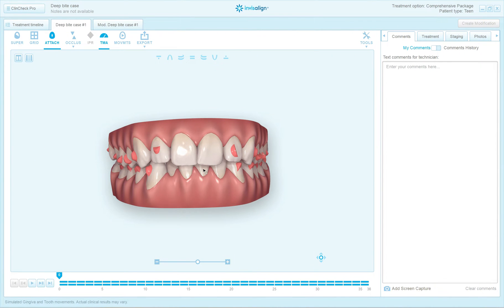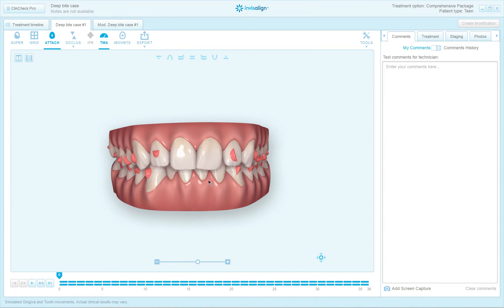Hello, I'm Dr. Brad Holmberg, founder of InvisalignDoctors.com. I'm going to show you how to set up a DeepBite case. I'm going to use the desktop version of ClinCheck Pro rather than the web version, because I went back to one of my old cases and created a sample of this case. I just called it DeepBite case — it's a sample case — so I can practice doing the 3D controls and show you how I would set up the case.